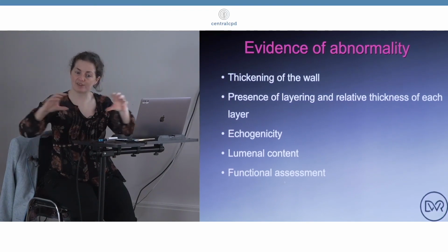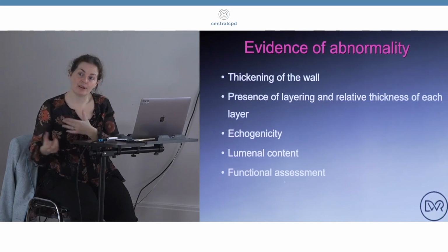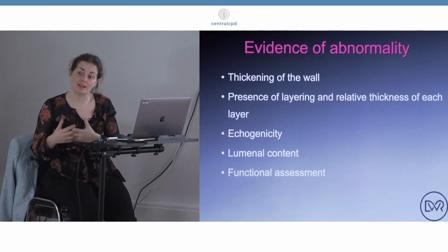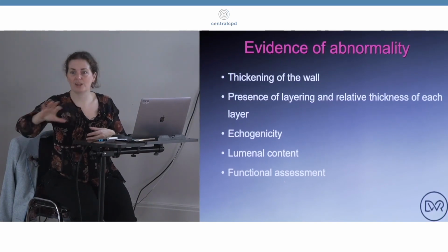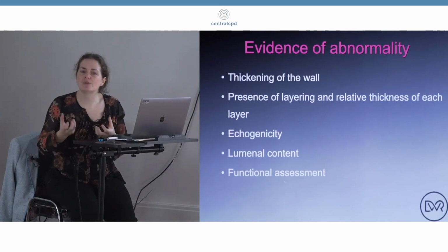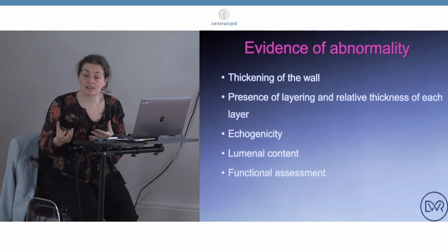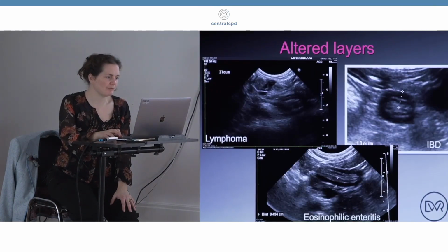And we tend to see them just sat there with some of the enteritises. We tend to see them hypermotile very early in an obstructive condition. Because if you think about it, the bowel is just desperately trying to push that obstructive thing down. So it really goes crazy. So you can get some subjective assessment, and that sometimes is present even in the face of sedation. Which I think is very helpful.